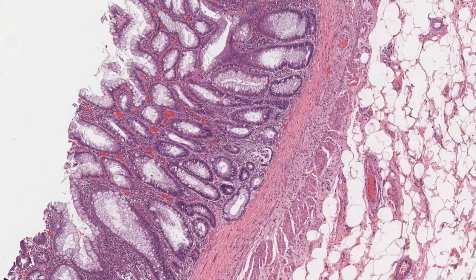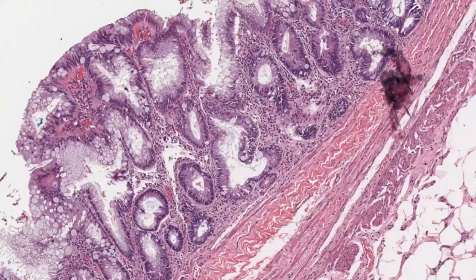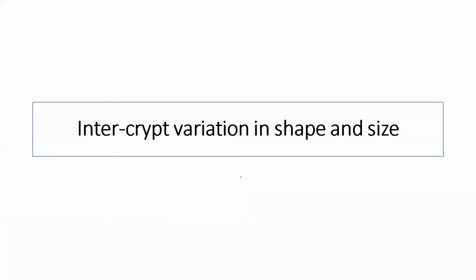But here in this corner, you can see that this is an angulated crypt. Again, I'm just drawing it and showing you the angle. It is again a 90-degree angle, and this form is really an angulation of the crypt. I tend to use angulation sometimes, which will result in this horizontal alignment that you see sometimes. But if you see the angulation, I describe in my report what I see rather than anything else. And this is again a close up on that tortuous crypt, just to show you these abnormalities.